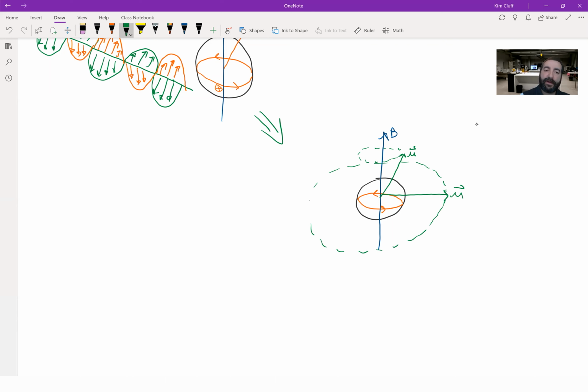So when that RF pulse comes in, the magnetic moment, because it absorbs energy, gets tilted on its axis like this, okay? And then when we turn off that RF pulse, the energy that the hydrogen atom temporarily absorbed, it'll release it and go back up to its original angle of precession.